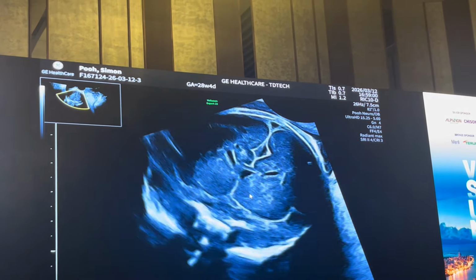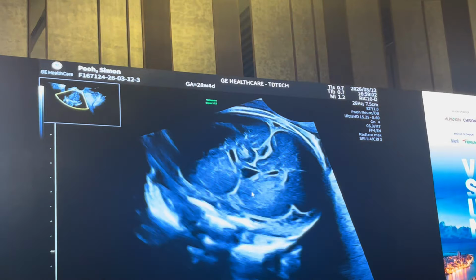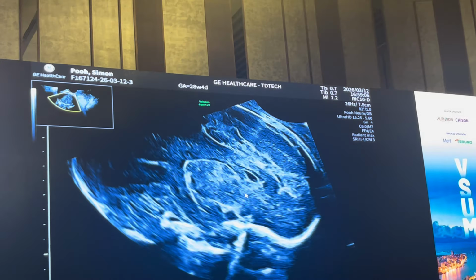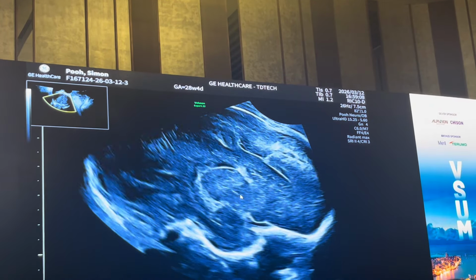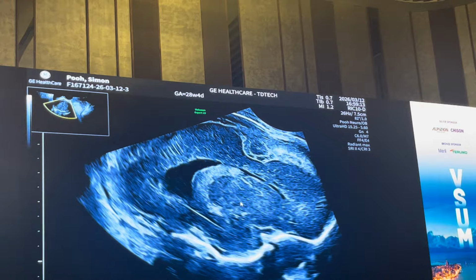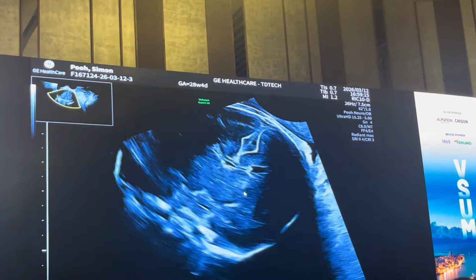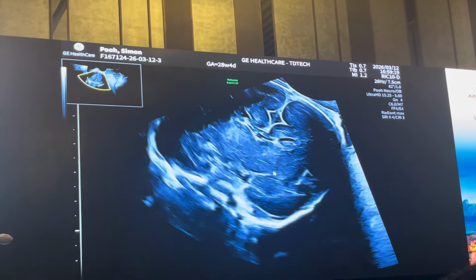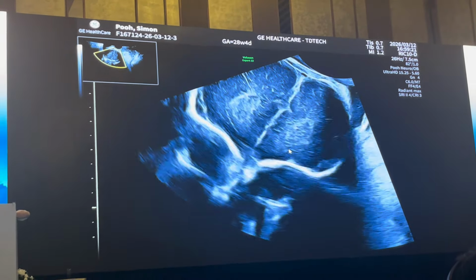Most likely. Okay. The sagittal image of the lateral ventricles. Can you tell me whether they look okay? So we're looking for any periventricular nodular heterotopia. We're looking for any bands and strands, any echogenicities in the caudate nucleus and thalami. So no to all of those for Tsuko.